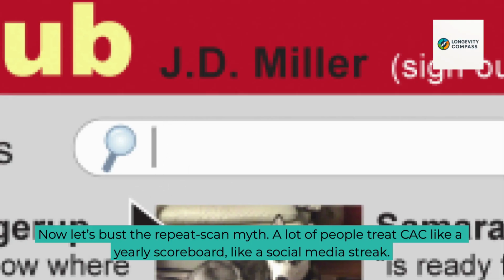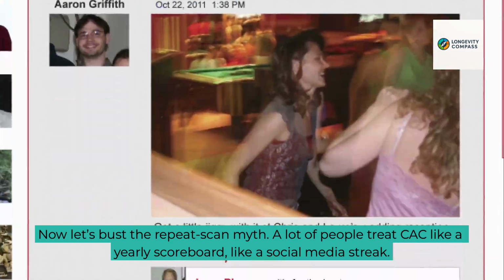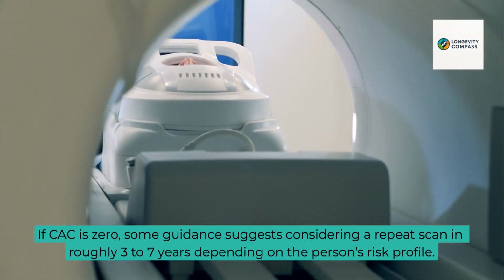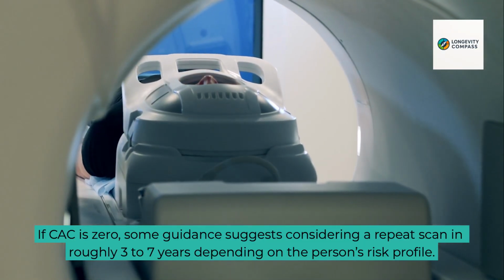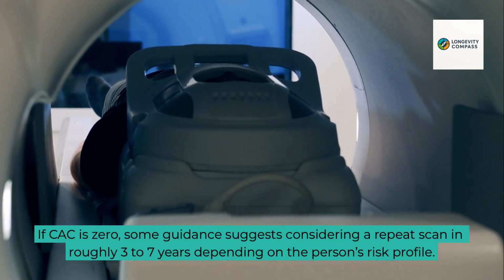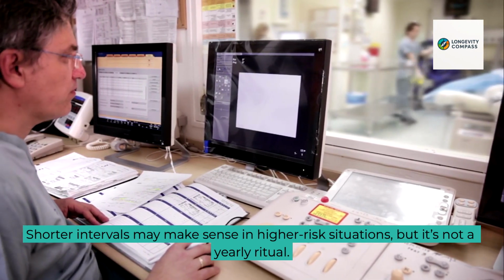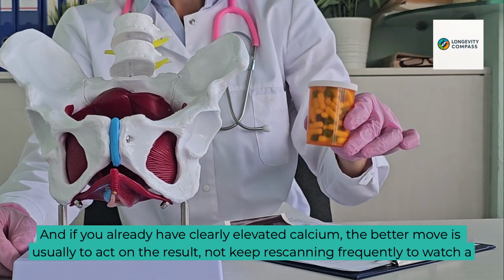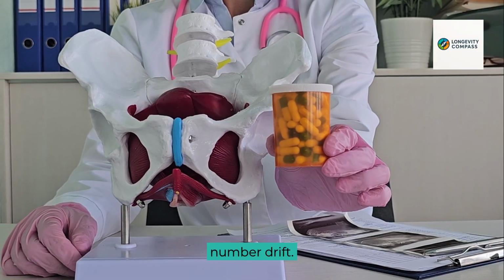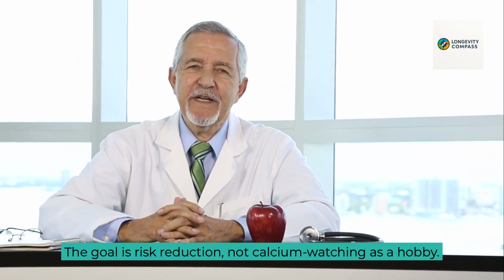Now let's bust the repeat scan myth. A lot of people treat CAC like a yearly scoreboard, like a social media streak. That's not the evidence-based use case. If CAC is 0, some guidance suggests considering a repeat scan in roughly 3 to 7 years depending on the person's risk profile. Shorter intervals may make sense in higher risk situations, but it's not a yearly ritual. And if you already have clearly elevated calcium, the better move is usually to act on the result, not keep rescanning frequently to watch a number drift. The goal is risk reduction, not calcium watching as a hobby.